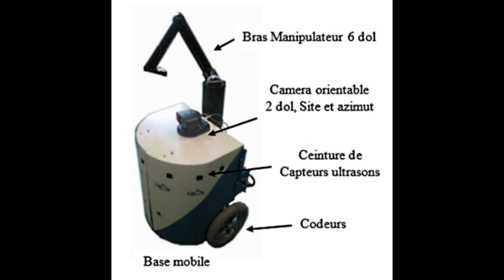This field of research requires multidisciplinary collaboration, both to take into account human-robot interaction, psychology, neuroscience, and the needs of end users: disabled people, medical staff, caregivers. This work has been carried out in partnership with the Rennes Experimental Psychology Laboratory and the Marseille Neuroscience Laboratory for Research, and the AFM as a user association.